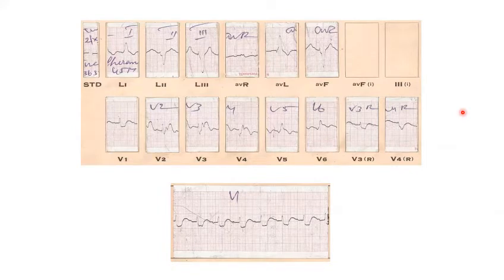Sir, in LBBB. One you have already mentioned, in a left axis deviation, it may indicate LVH. Second? Sir, QRS complex more than 45. Total QRS complex. No, sir. I mean S in V1 plus R in V6 more than 45 in presence of LBBB. Okay. The criteria applied for electrical hypertrophy can also be applied.